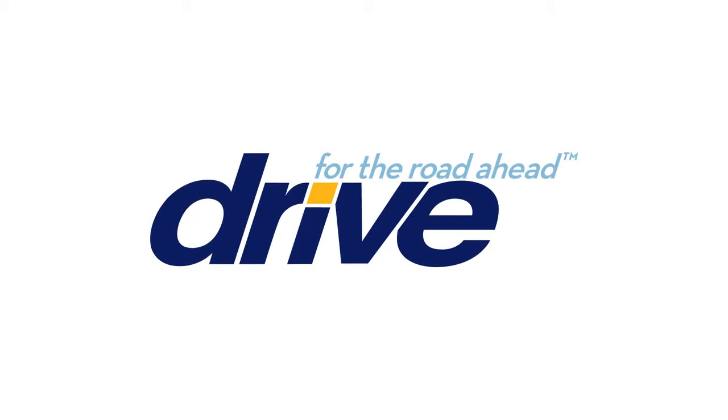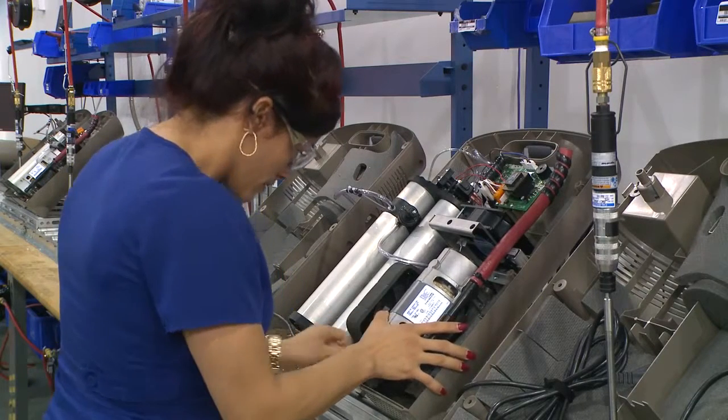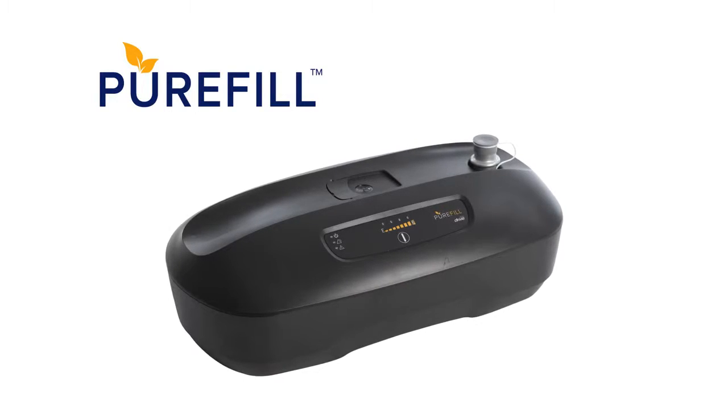Thanks for choosing DRIVE Medical's PureFill Oxygen Compressor System, proudly manufactured in our state-of-the-art respiratory research, development, and testing facility located in South Florida. Please enjoy this short overview of the features, benefits, and functionality of the PureFill Oxygen System.